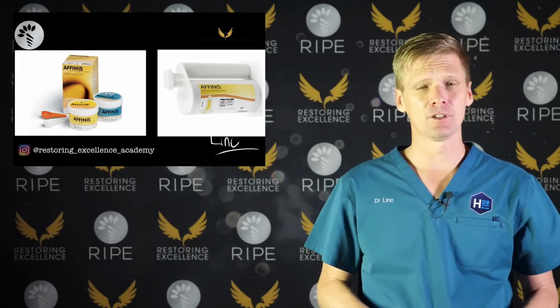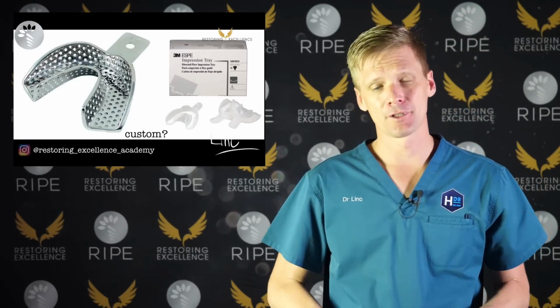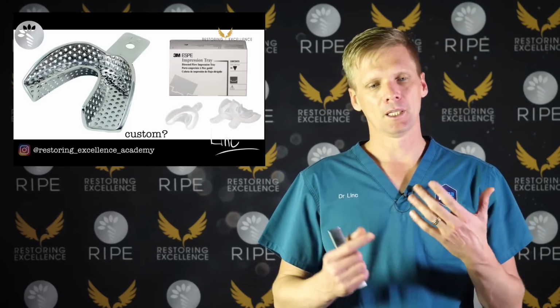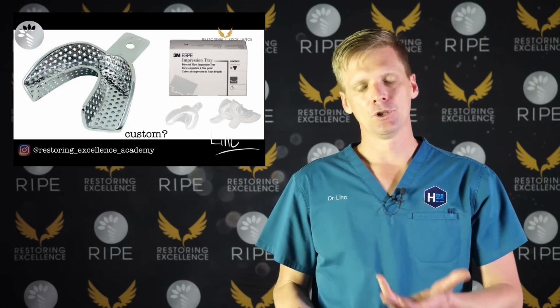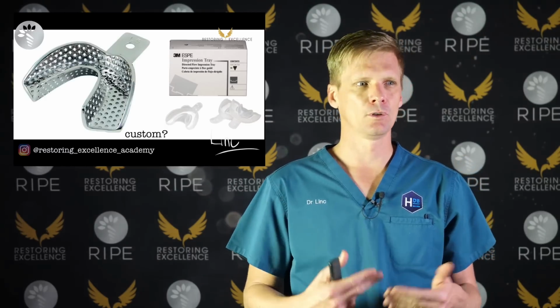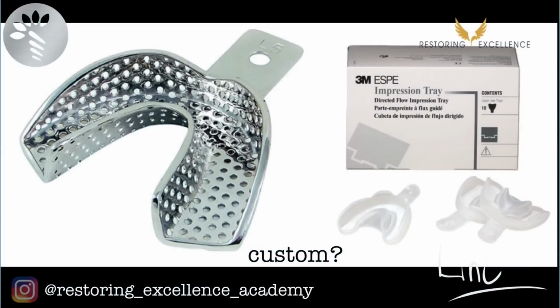Trays, I hardly ever use custom trays. So I used custom trays when I was trained. I hardly ever use them now. Mostly I use that 3M tray that you can see on the screen there. It is a border lock disposable tray. You could use a metal border lock tray. So if you are in an area where you can't throw out 3M trays all the time because they're too expensive, then just get a metal border lock tray.